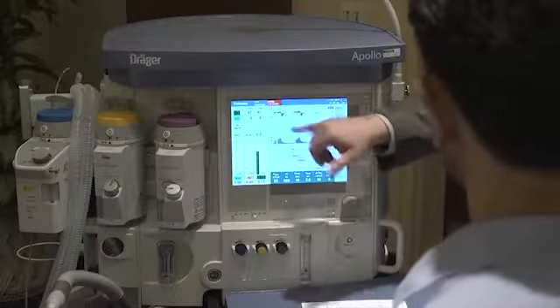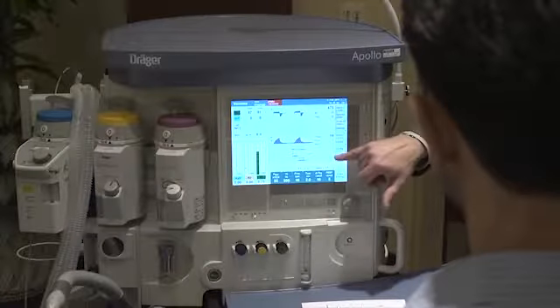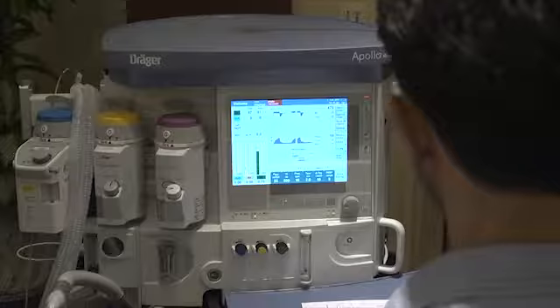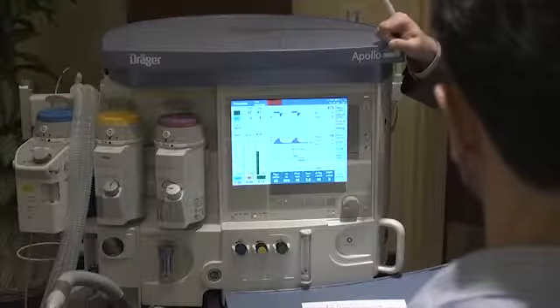Well, you get an apnea pressure alarm, and then the next breath you say, oh, I was at 19, now I'm at 18, then I'm at 17. Well, you've got to correct the situation because we're going in the wrong direction here. So that's really what that alarm is designed to do.